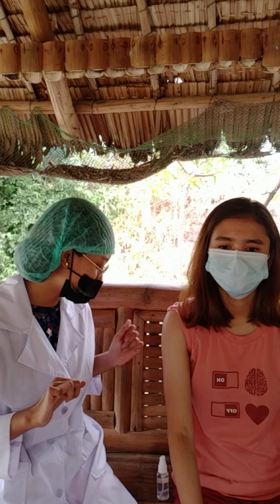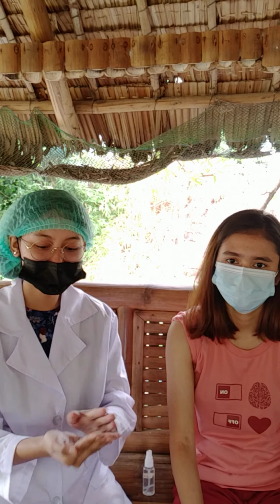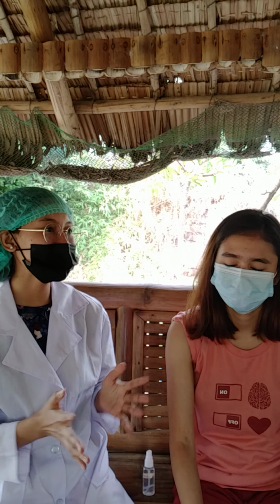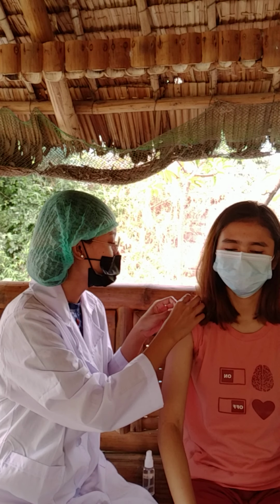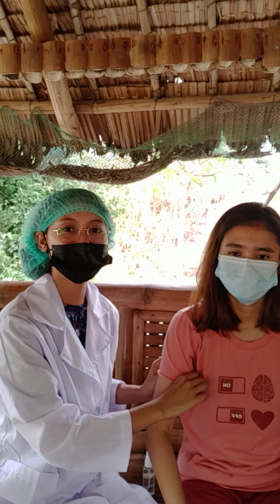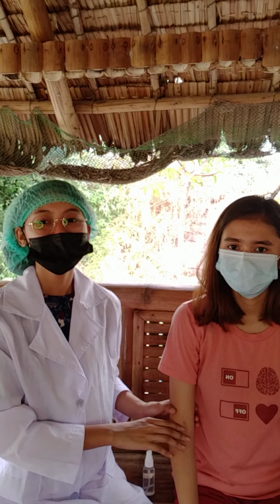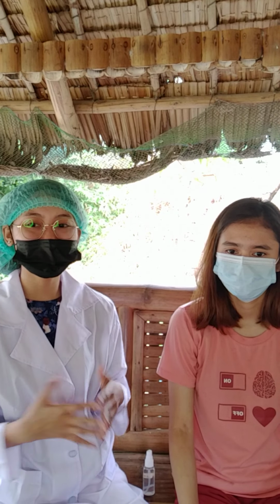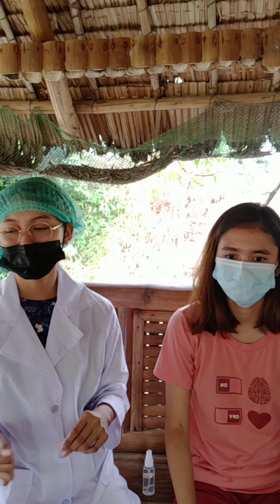And then after that is alcohol to remove all the microorganisms. And then after that, help the patient in an appropriate or in a comfortable position. So ayos po tayo, ma'am. And then after that is clean the diaphragm of the stethoscope with the alcohol wipe.